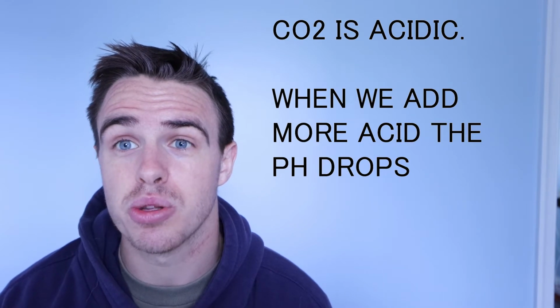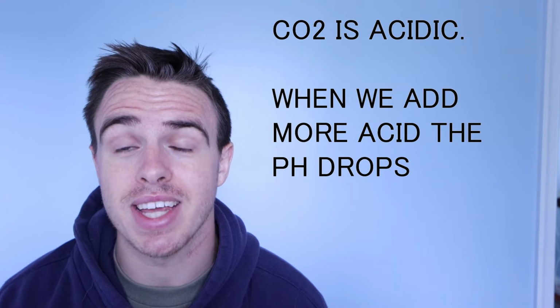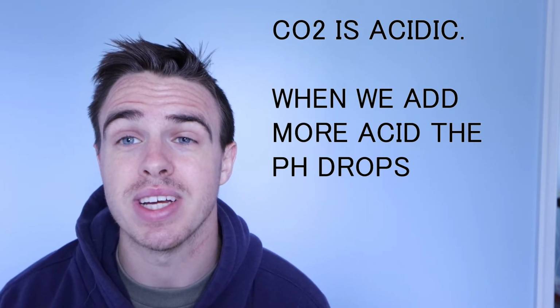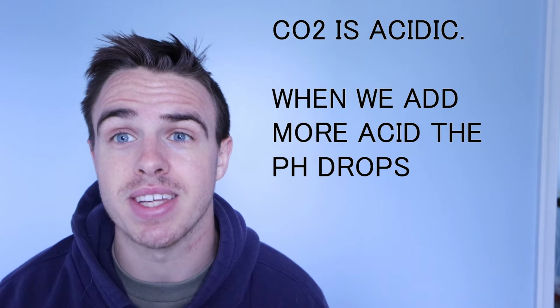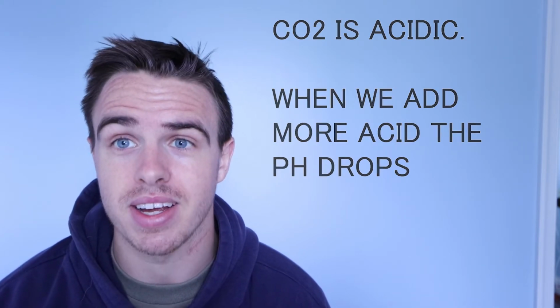So if we have more CO2, the pH is going to be more acidic. If you look at this one, once again, the pH is 7.30 and the CO2 is 48. So therefore we have more CO2 than we need, so it's going to make the pH more acidic. So remember that, more CO2, more acidic.